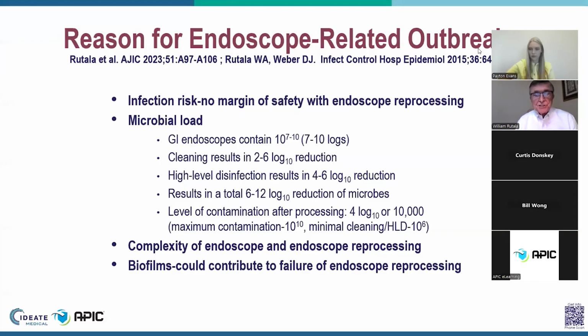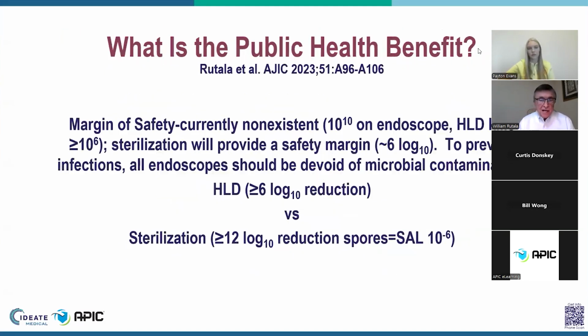Now, of course, we're going to see the other problems with reprocessing endoscopes is the complexity of the endoscope, and of course, biofilms can contribute to failure of endoscope reprocessing. On the next slide, essentially, we're going to continue with this thought of margin of safety.